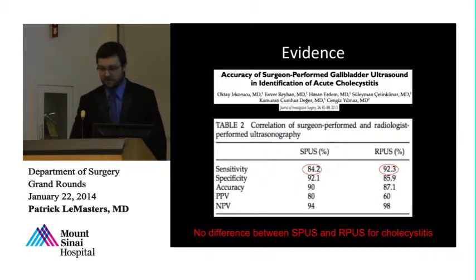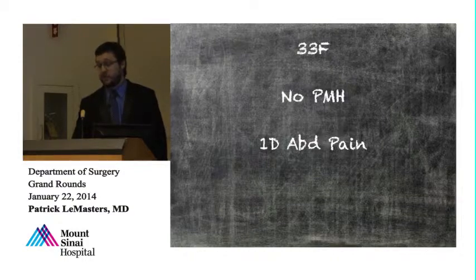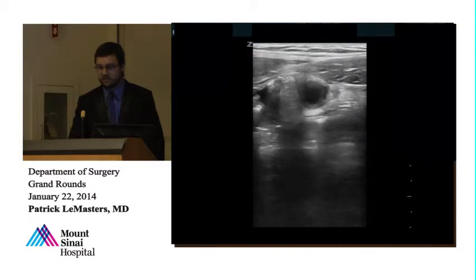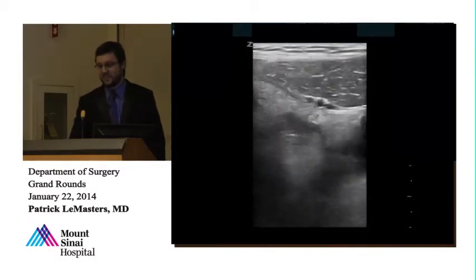Let's go over another study, which is basically my favorite and the one that I've actually got most of the satisfaction from in performing. So let's say we start with a 33-year-old female. She presents to the ED. She has no past medical history. She has 1 day of abdominal pain. This time you have a very zealous ED physician, and they come up to you and they say, look at this. This is what I found. And you're looking at it, checking it out.